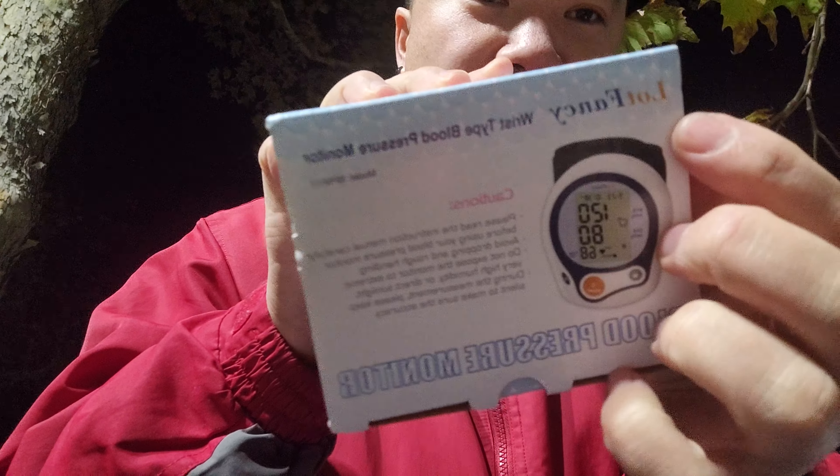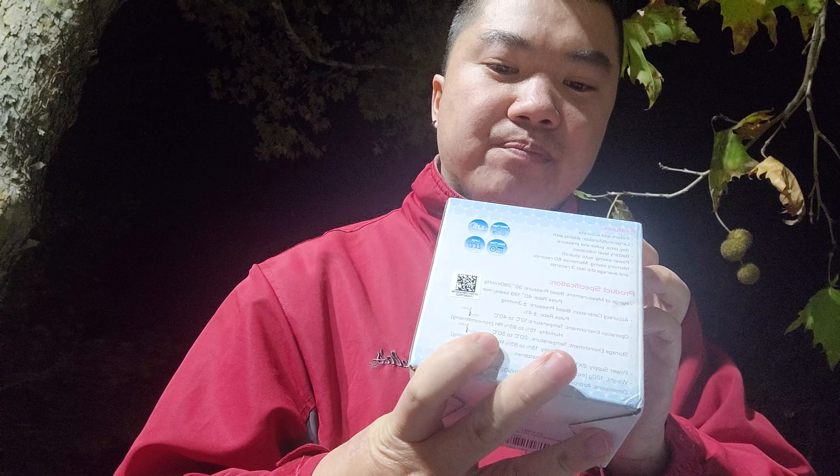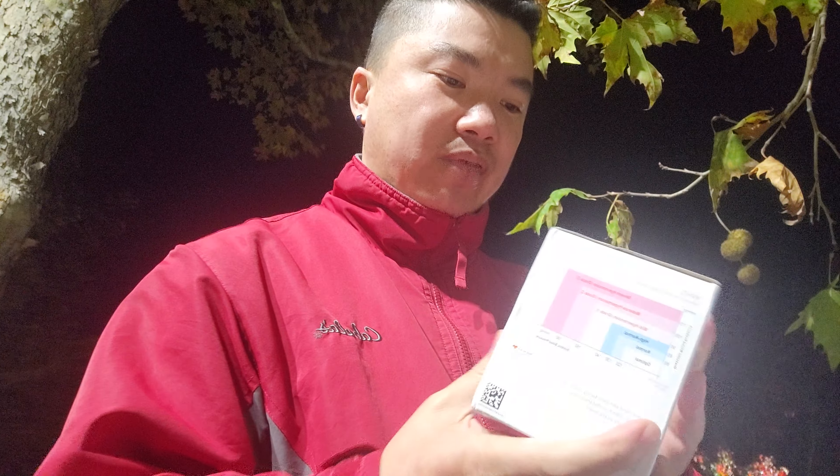It's called LOTS Fancy — L-O-T Fancy. Wrist type, so you put it on your wrist. It has a diagram on it. The camera angle is kind of flipped over, sorry about that. There's a diagram on the side showing what's considered normal and what's considered not normal. It gives you a range of blood pressure.